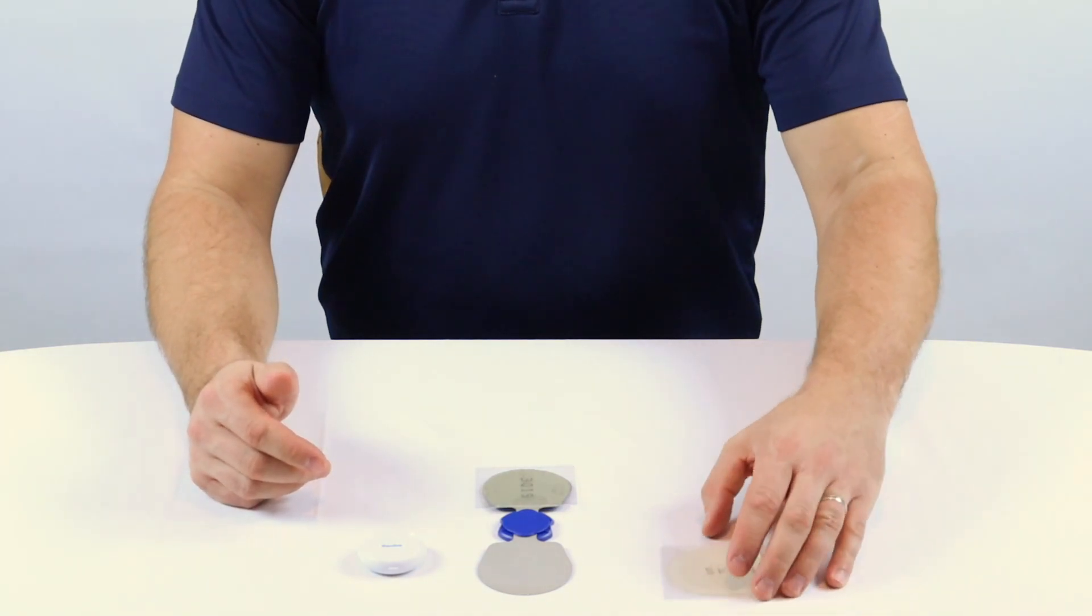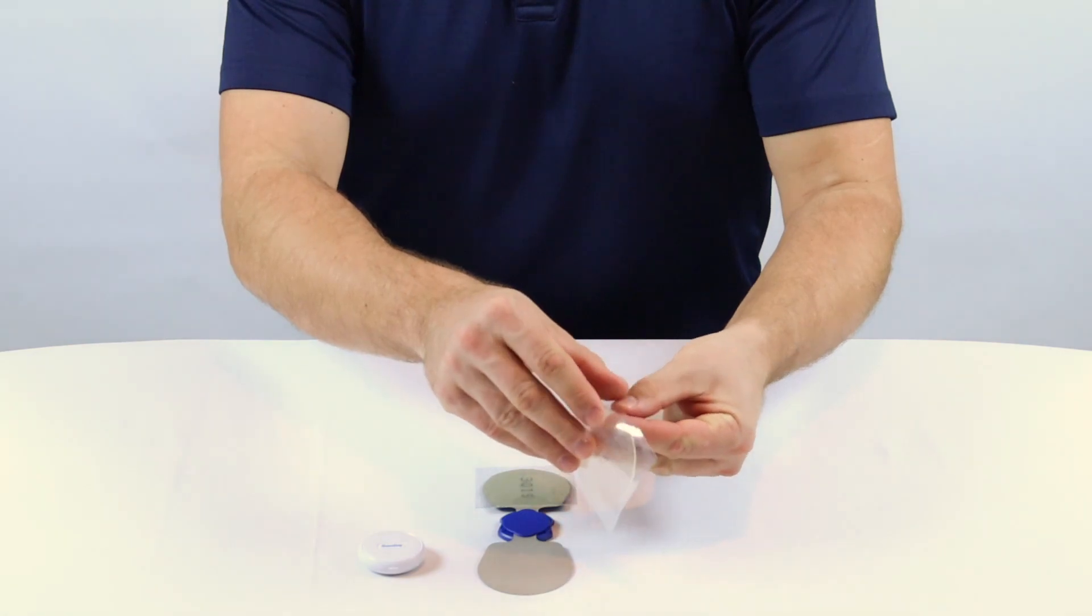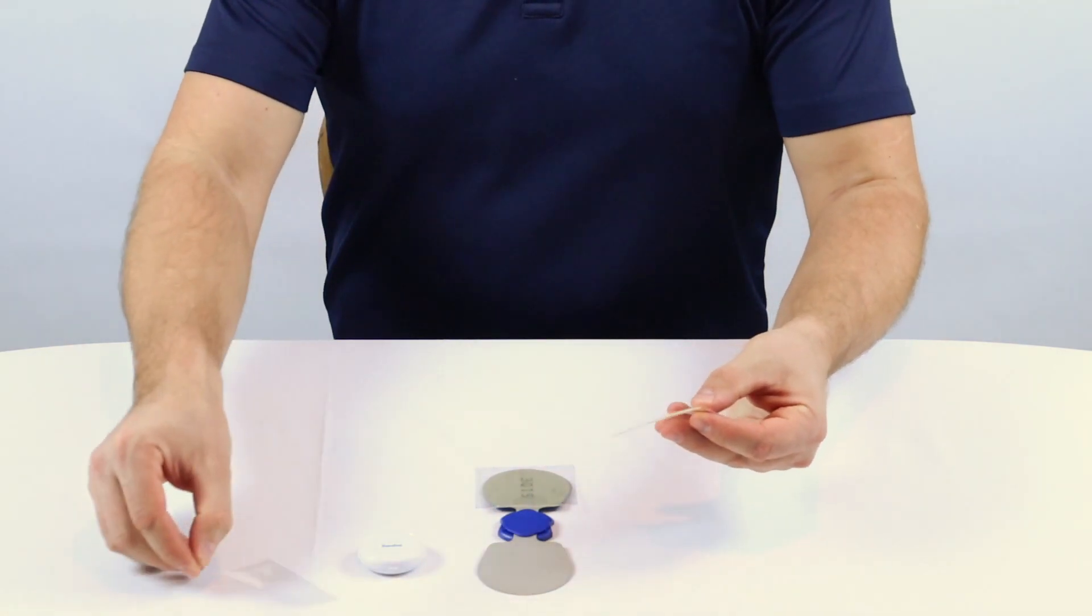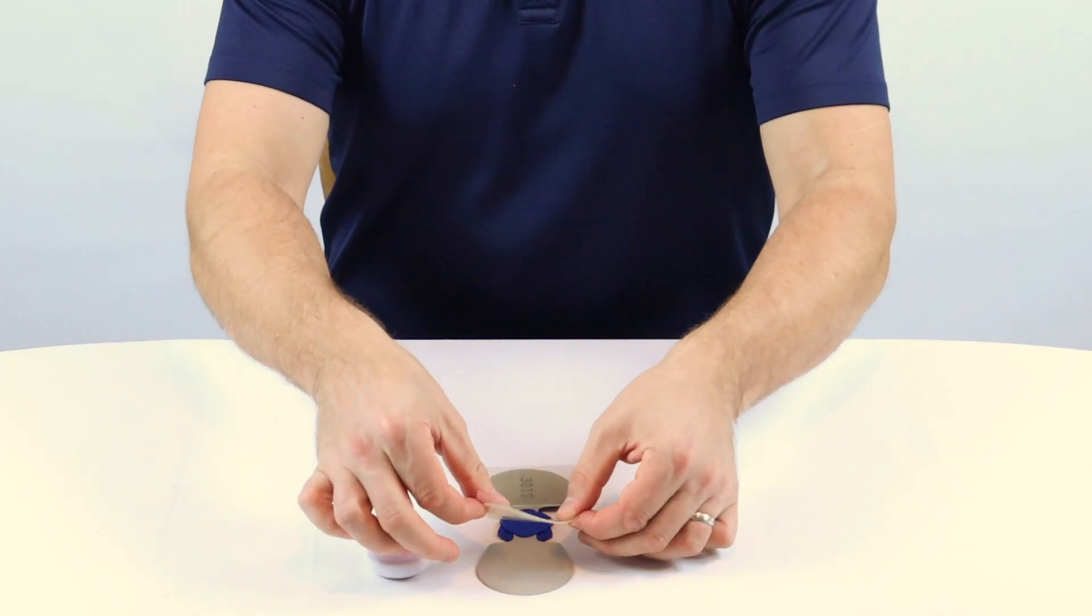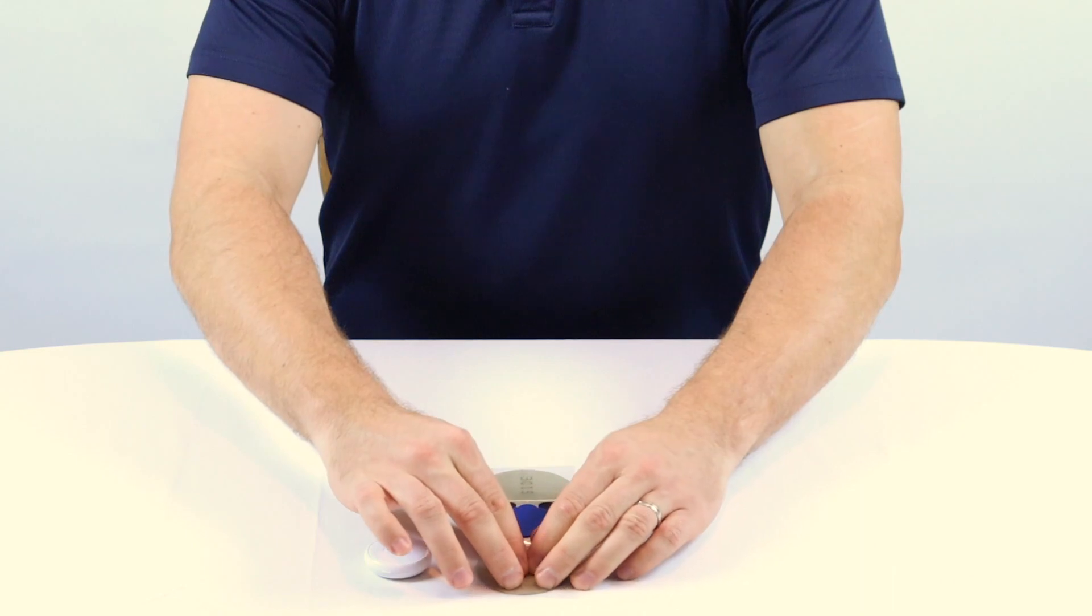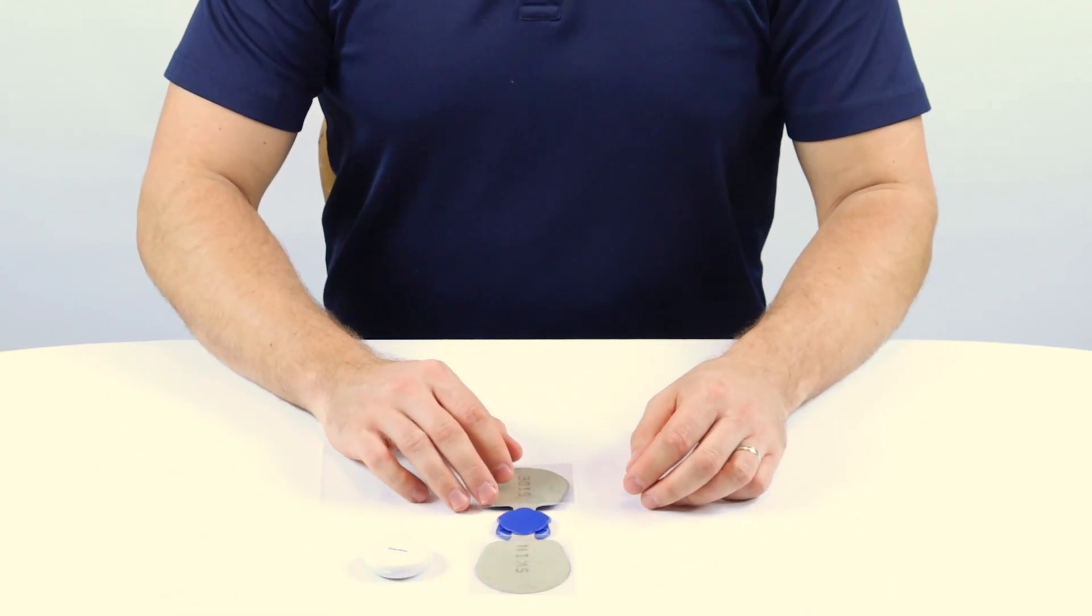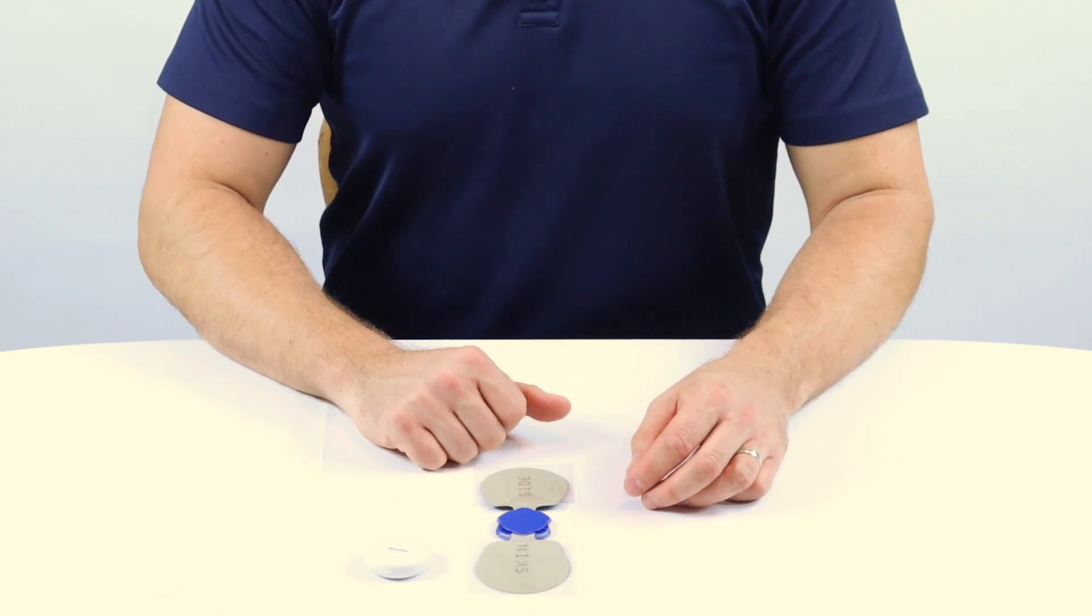Next, to place the new gel pad onto the wing, expose the side of the gel pad without writing on it, line up the edge of the gel pad with the same edge of the wing you started rolling the gel pad from, press down, and the pad is on the wing. Do these same steps to the other side and you're ready to use your new gel pads.